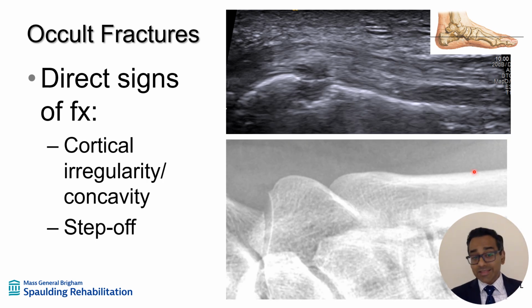Again, this is that analogous picture on the x-ray. I really don't see much on the x-ray here, but that ultrasound is really quite clear. This is an occult fracture of the base of the fifth that was not picked up on x-ray, but ultrasound led us to the correct diagnosis.